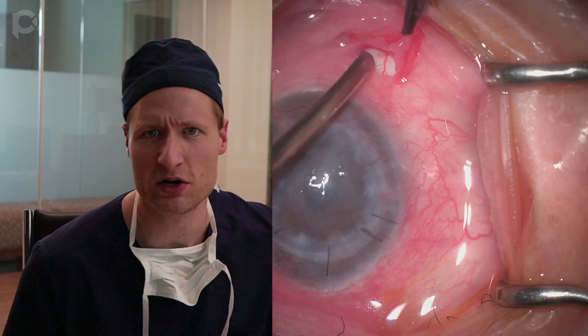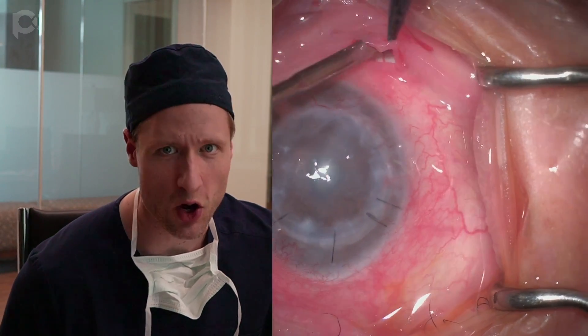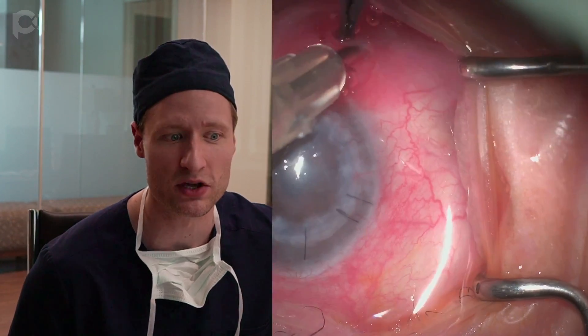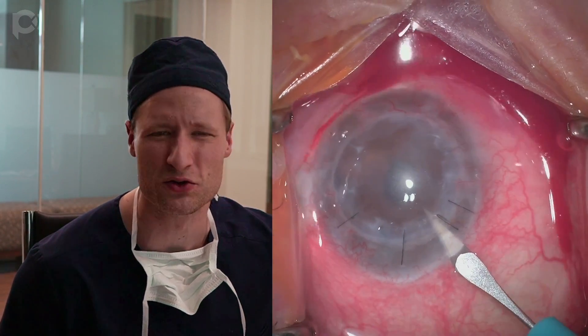DMEK in monocular patients is always a special privilege but also a particular pressure to perform. If you have a patient travel from far away with only one eye, especially if that eye is sick and has been operated on by good cornea specialists in the past, it gives you pause because you really feel like you need to do a good job. This is a gentleman who traveled from far away to see us. This is his only eye. He's had three failed penetrating keratoplasties in this eye, and the eye is also glaucomatous with an inflamed-looking filtering bleb at 12 o'clock.